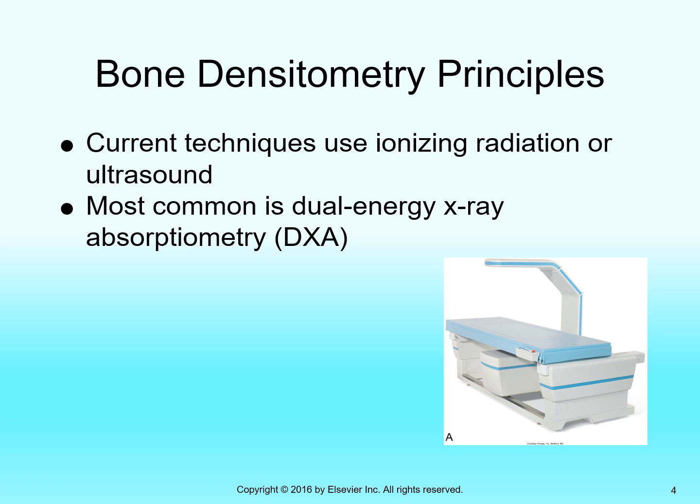You get a composite image that reveals the calcium content of the tissue in the beam. That's where the word DEXA comes from: dual energy X-ray absorptiometry. DEXA for short.